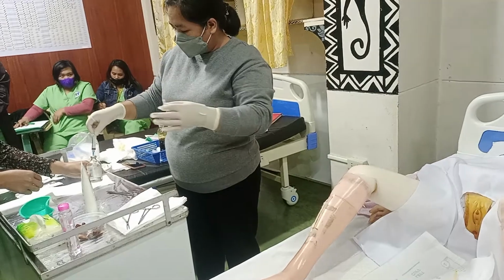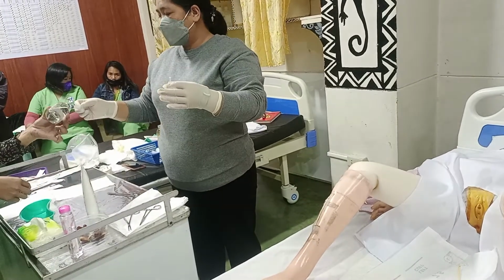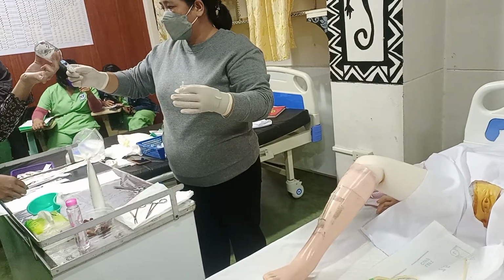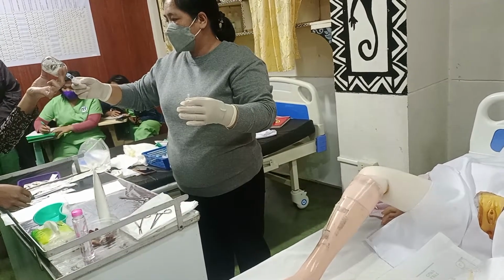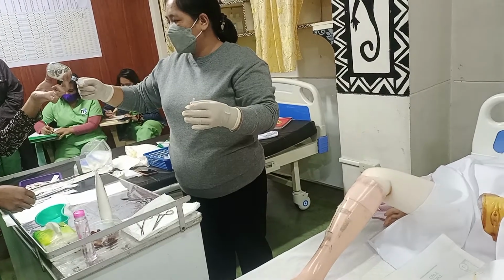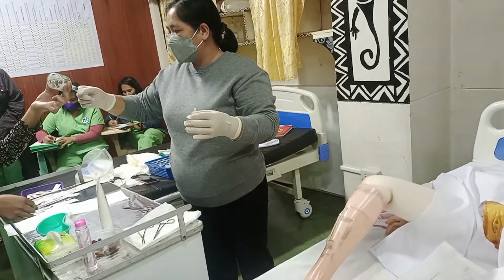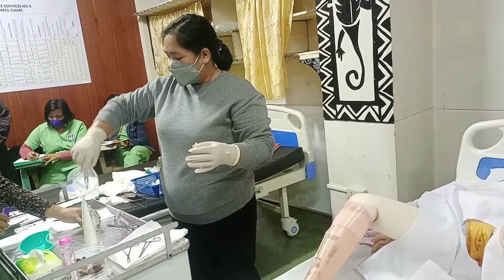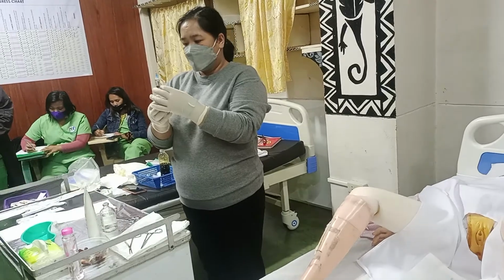Sige ma'am, baliktad doon. Itaob mo para makapakuha ako ng water. Okay, so I will use 2.5 since yun ang advisable para sa aking urinary catheter. Okay, thank you ma'am.